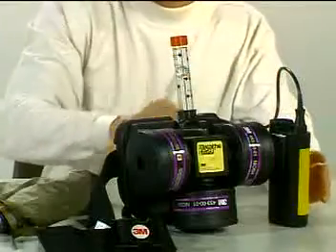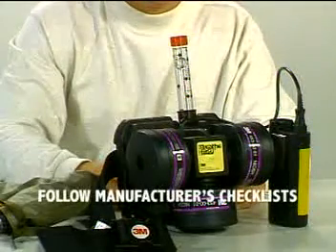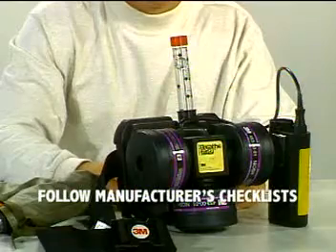PAPRs should not be used until all pre-operational checks are performed in accordance with the manufacturer's instructions. PAPRs also require the wearer to be medically cleared, especially for conditions associated with increased airway resistance.